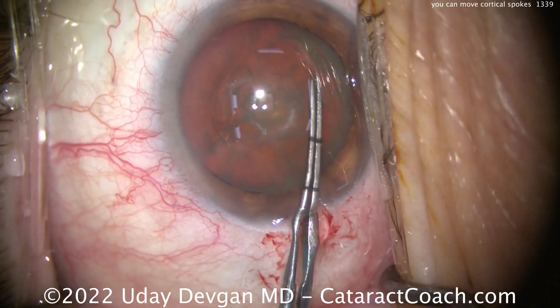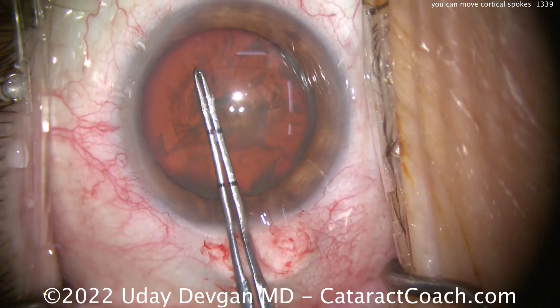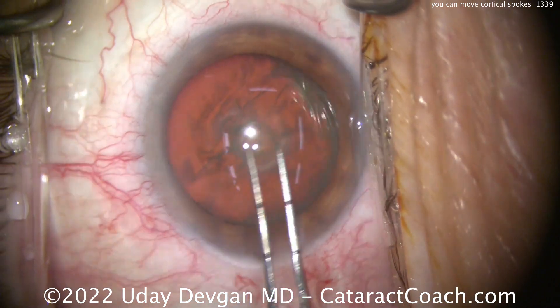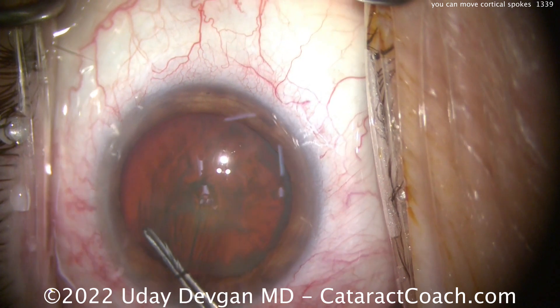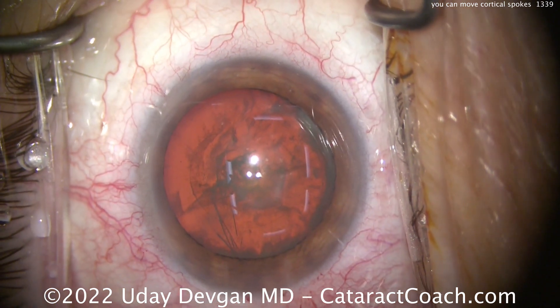Continuing this capsulorexis all the way around. And just like that, you're able to remove that opacity from the path of your intended capsulorexis. And there we go.